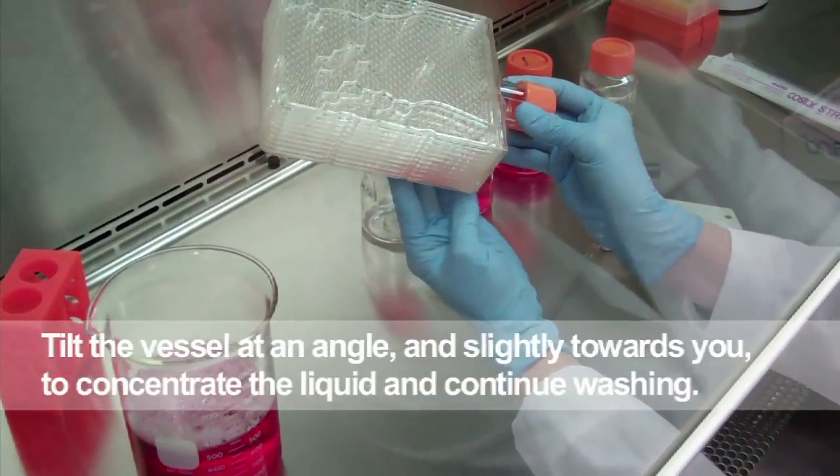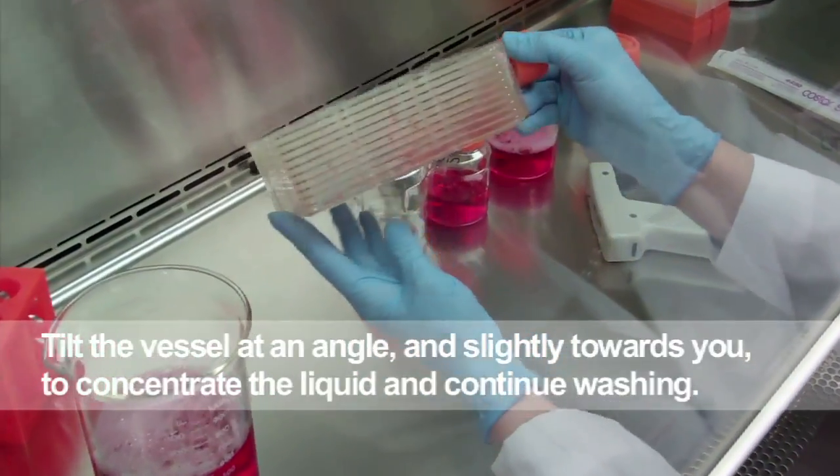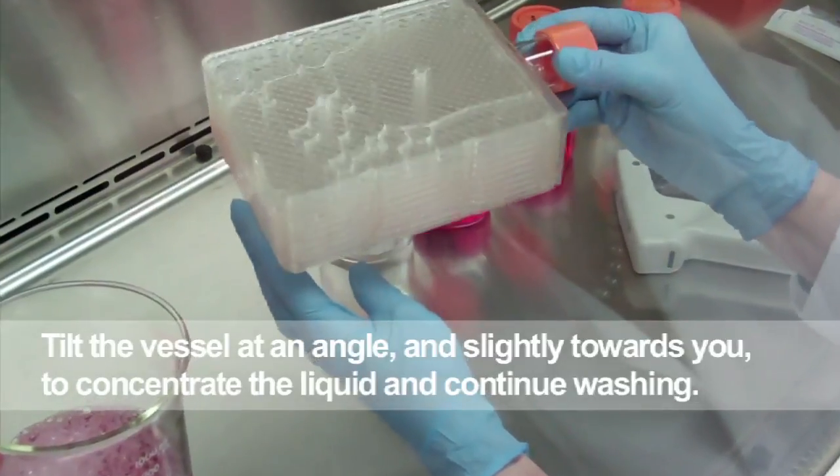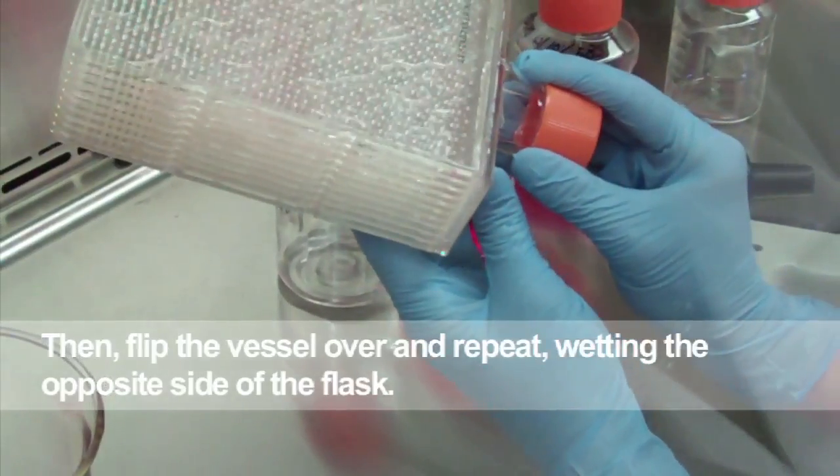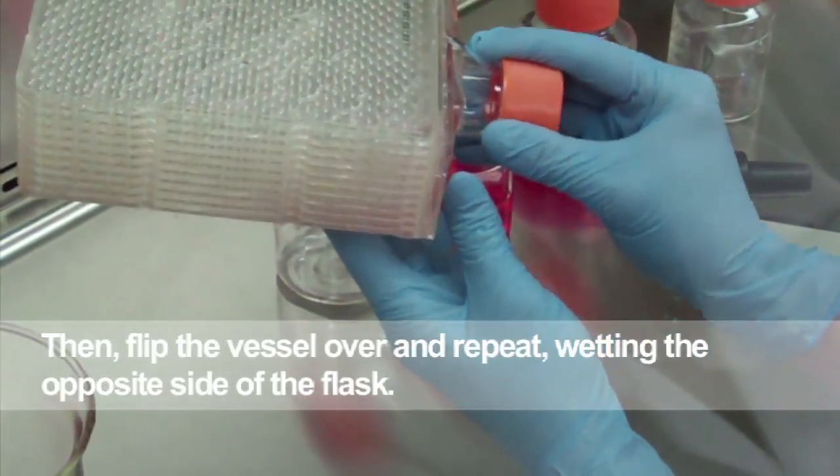To thoroughly wet the surface, tilt the vessel at an angle and slightly towards you. The liquid will concentrate on the bottom layers, allowing a greater volume to wet a few layers at a time. Then flip the vessel over and repeat, wetting the opposite side of the flask.